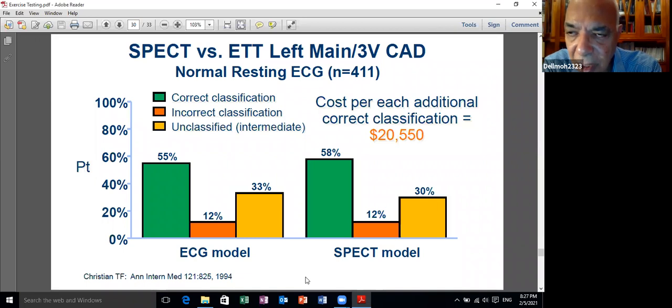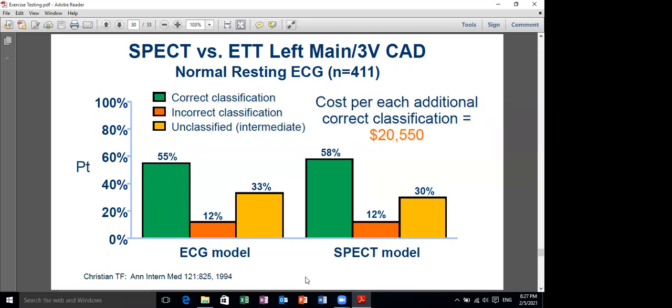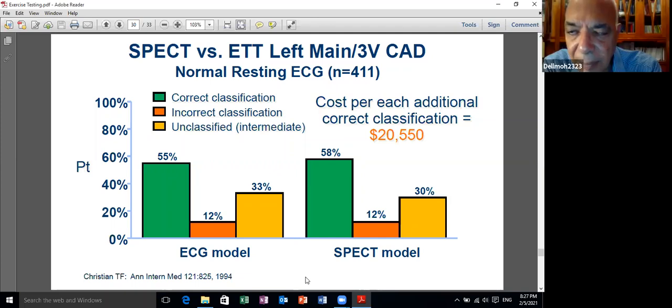اي سي جي at the same time contra indication للاكسرسايز imaging and is an indication for vasodilator زي adenosine or regadenoson imaging. So this is the story of the left bundle branch block.